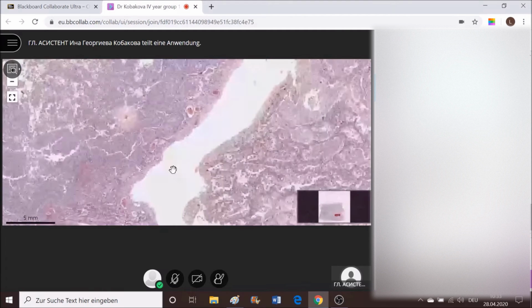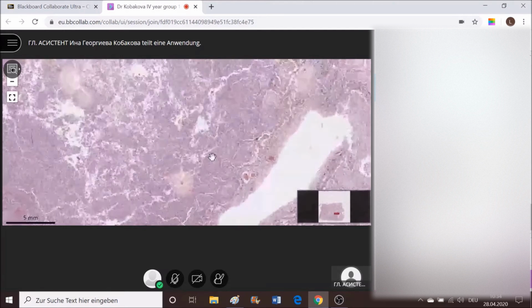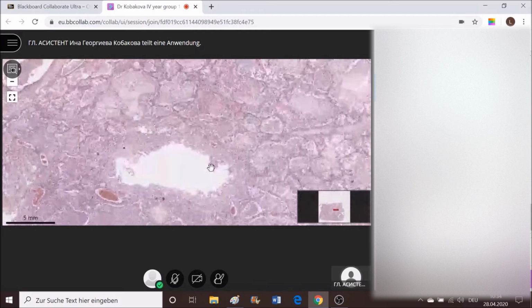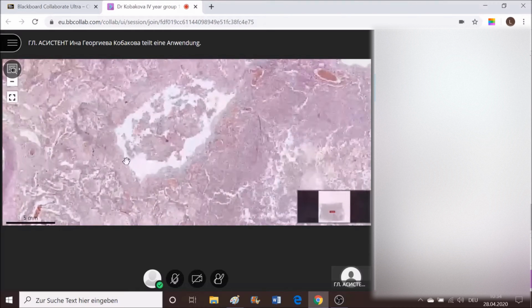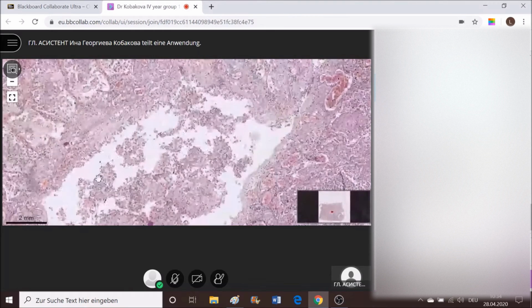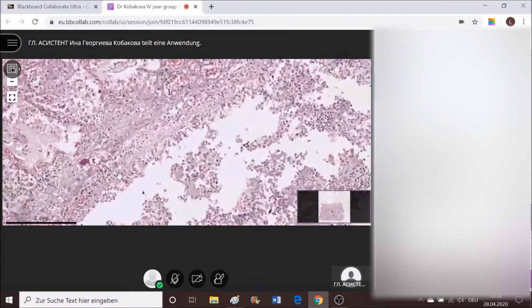This is something that I don't consider to be a bronchus actually. This is a vessel, this is a vessel. Bronchus. Yeah, there it is, a bronchus covered by respiratory epithelium. It's a little bit smashed and desquamated, and inside it's filled with inflammatory cells, but the respiratory epithelium is well recognizable. Here, what I see are lots of dilated vessels filled with erythrocytes.